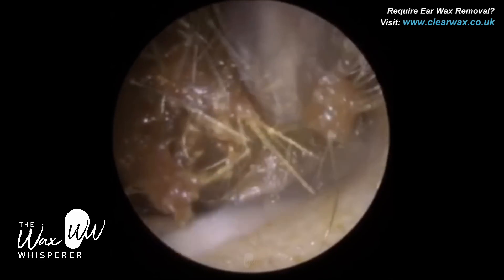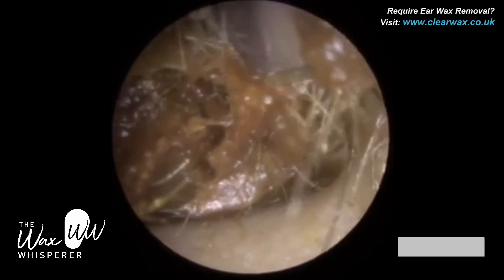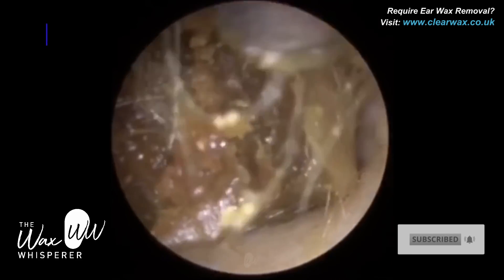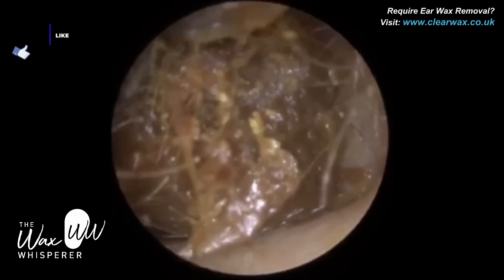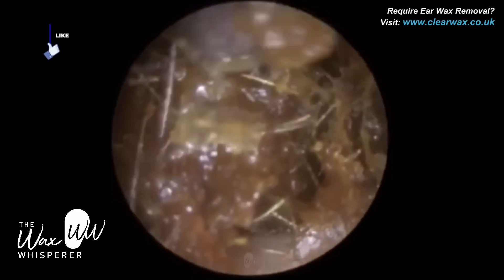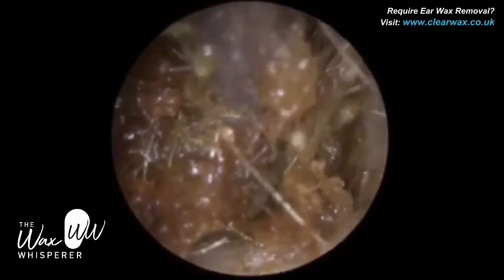The plug of wax is quite sticky, and there's a few matted hairs. We're at the entrance of the ear canal, and a good way of knowing that we're at the entrance is by these hair strands that are visible. So the outer third of the ear canal, the cartilaginous portion, is where the hair follicles are situated.